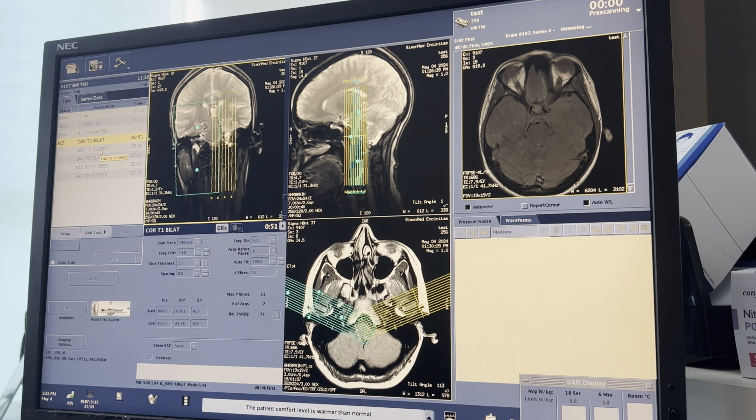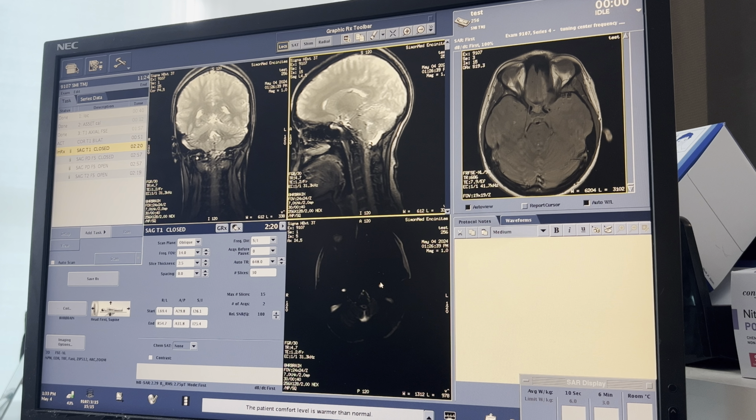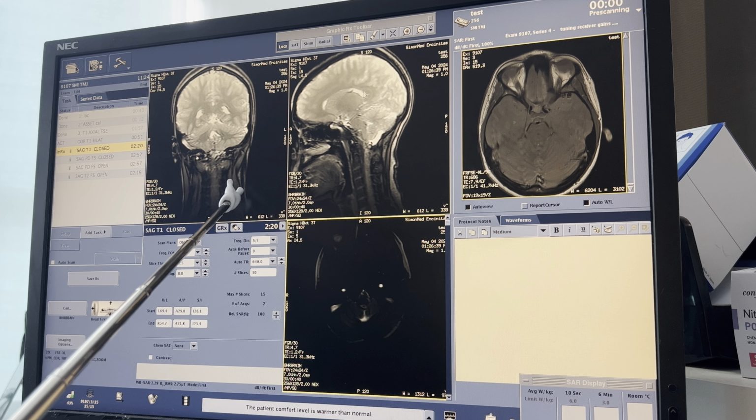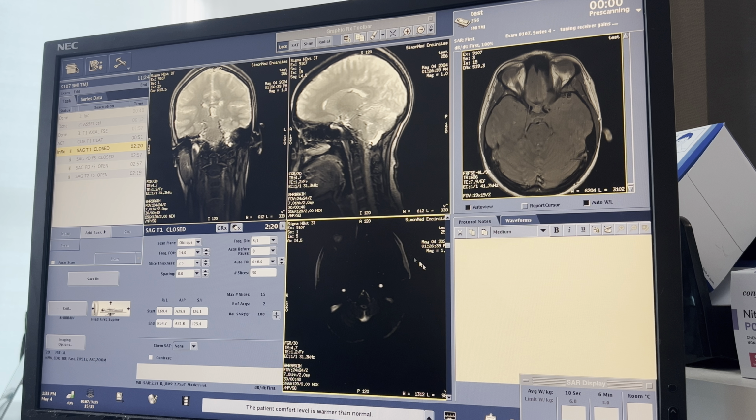And now we're going to go into that sagittal, and we're going to do the same thing. We're going to pull up those IACs or Shrek's ears right there. Perfect. We didn't get great images for Shrek's ears, but I'll show you guys on the new Axial.